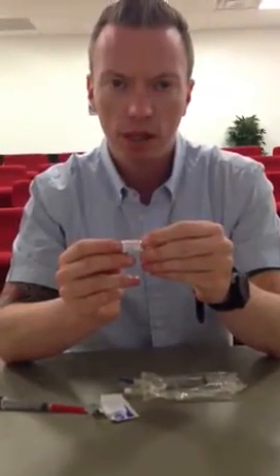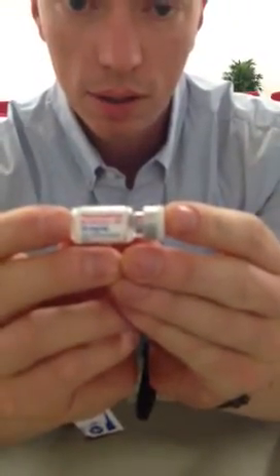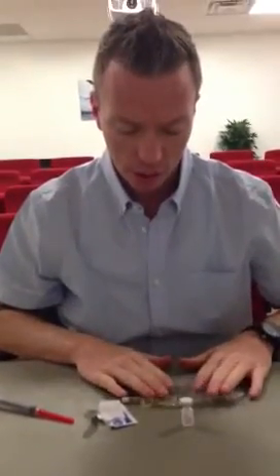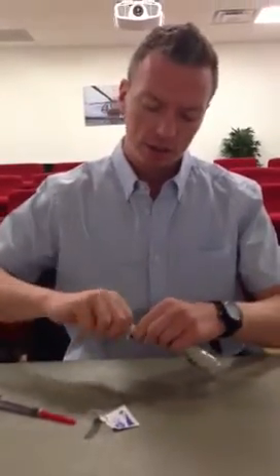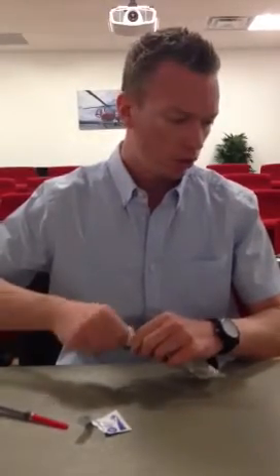This is 10 milligrams in 1 ml, and what we're going to do is put 10 milligrams in 1 ml into 100 cc's of normal saline. Put it over here, pop the cap on that. We're going to clean our bag where we're going to be adding the medication.